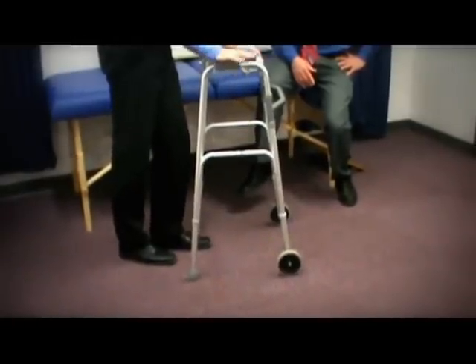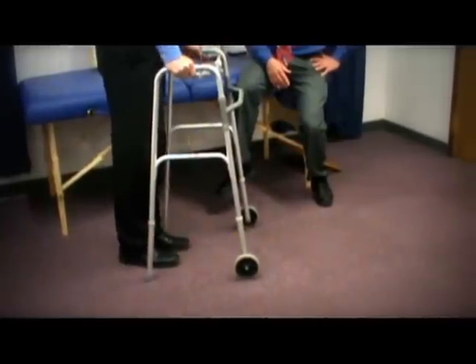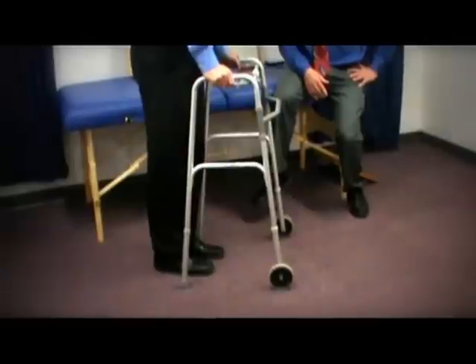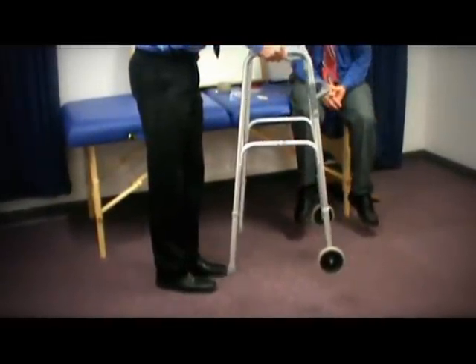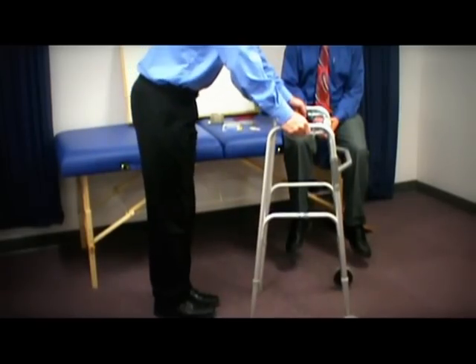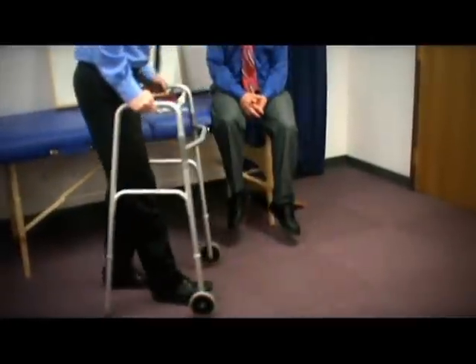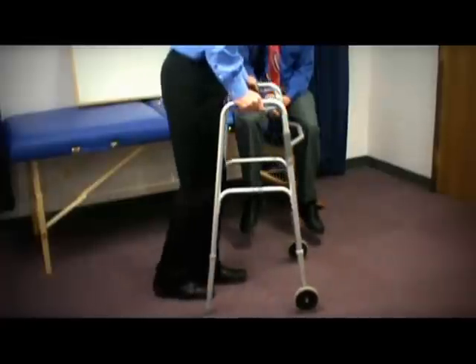The reason it's better than a regular walker without wheels is because if you're walking along, let's say you had a knee replacement, when you have to pick up the walker, you have to balance. And you're at risk for falling. As soon as I lift it up, put it back down, take a step, pick it up, this is where I could fall. If you have the wheels on it, you just push it along and you always have stability there.